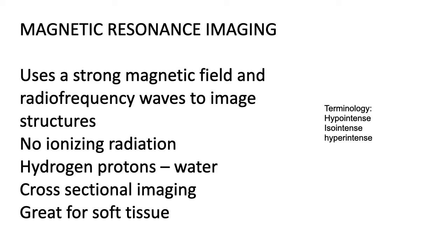Okay, so also the terminology, we have hypointense, isointense, and hyperintense. But you have to check what is hypointense, just the concept. Remember, just the concept of hypointense, isointense, and hyperintense. Okay, remember the same thing, from black to white. So remember, in MRI we talk about intensities, and in CT scan we talk about densities. So you have to compare that.